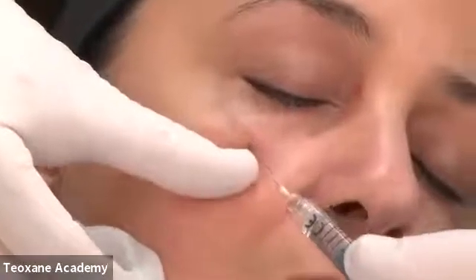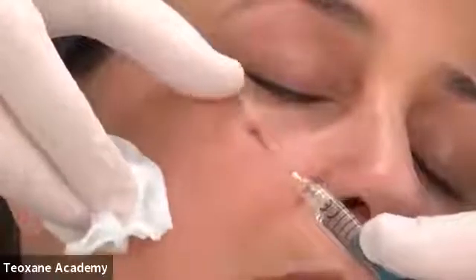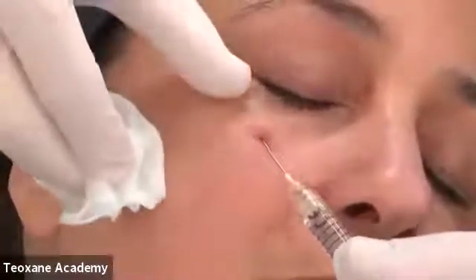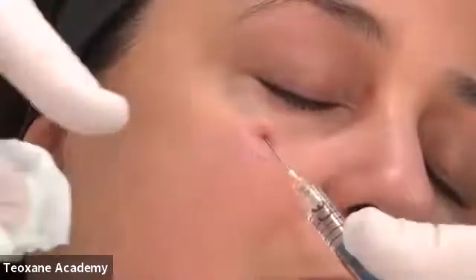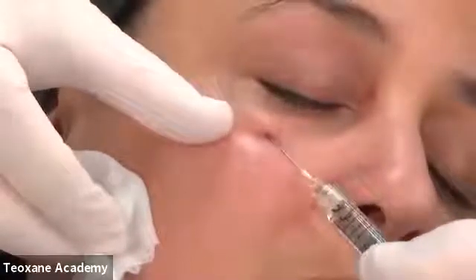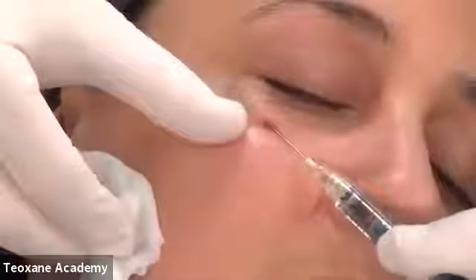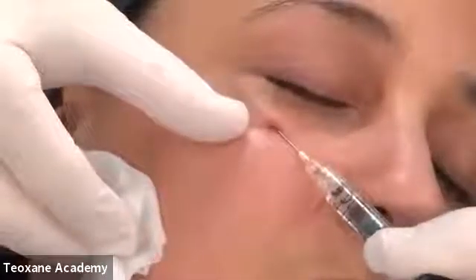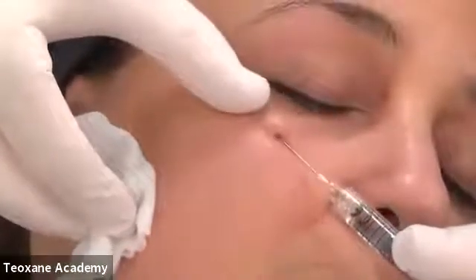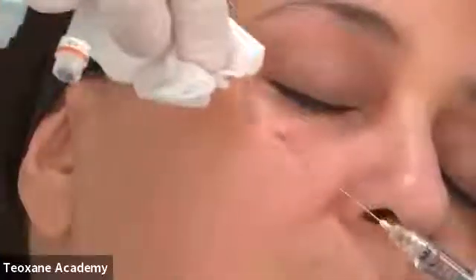So for that, I'm deep, I'm going here, and I will feel a little resistance here because you know that I will have to go up along the palpebral malar groove. And I will inject slowly a little amount of product, and normally I put an average of 0.2 ml of product in this area. That's all, it's finished. I put 0.3 in the tear trough and 0.2 in the palpebral malar groove.